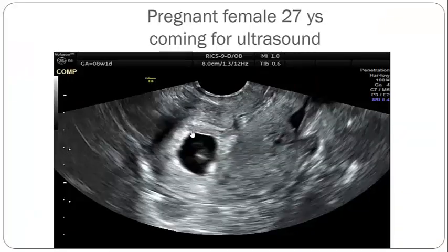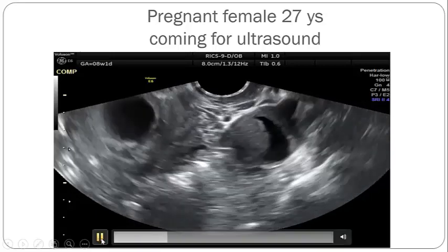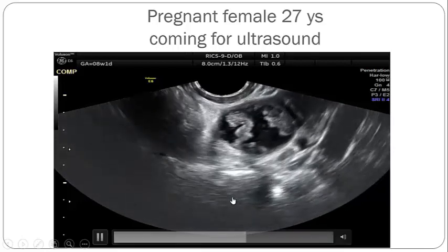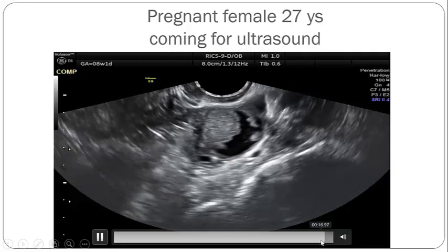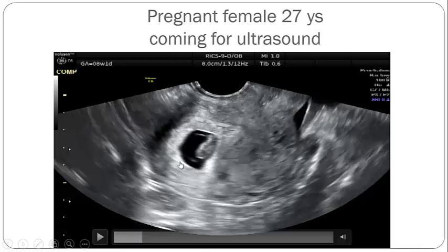Our first case, a pregnant female, 27 years old, and coming for ultrasound. And when she did ultrasound, we found these findings. This is the normal fetus here. And there is something here in the left adnexal region. Again, we have here the normal fetus.